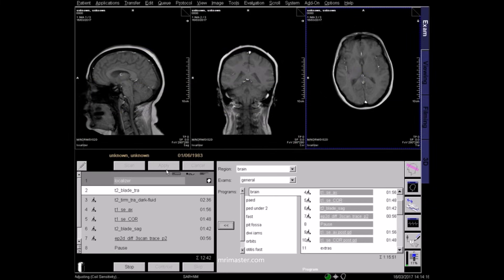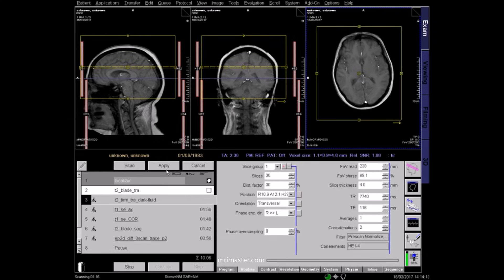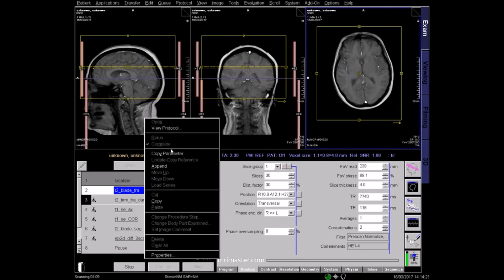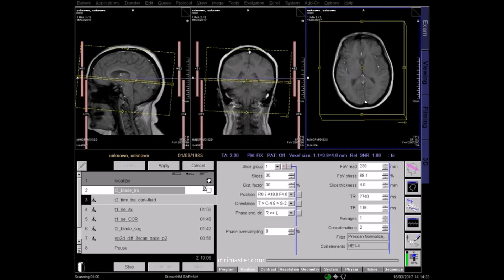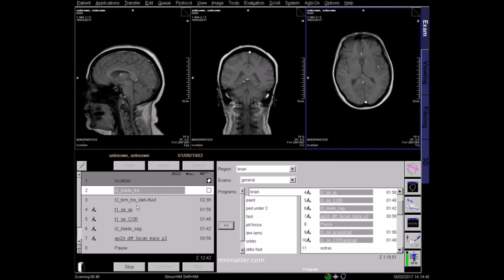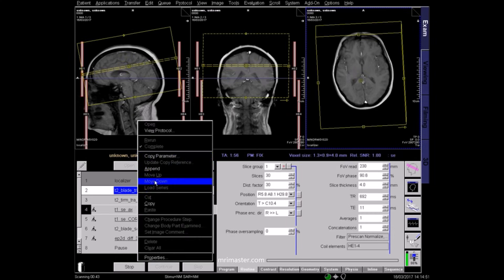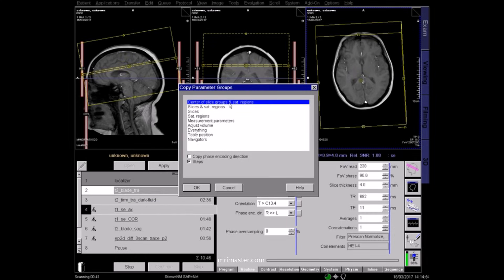Now plan the next axial sequence. You can copy the planning and centering from your first T2 axial. Make sure the coverage and centering are correct, and apply. Repeat this process for the T1 and any subsequent axial sequences.